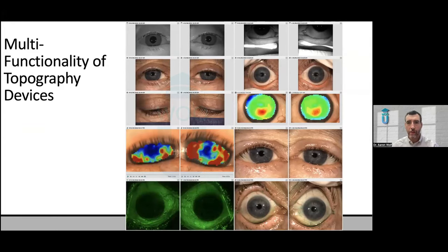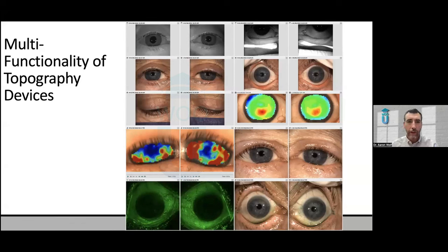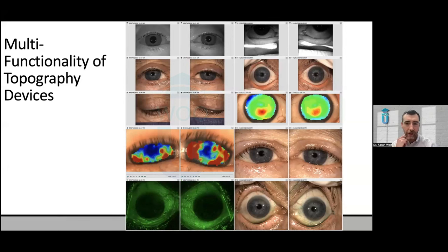I use these devices on all my patients — basically all ages. I run everything on everybody. Infrared imaging is invisible light, so patients don't sense it shining, making it excellent for truly observing ptosis, dermatochalasis, pupil abnormalities, anisocoria, conjunctival injection, lid erythema, and lid wiper epithelopathy. Outside of corneal screening and corneal mapping, there's so much more you can do with all these images.